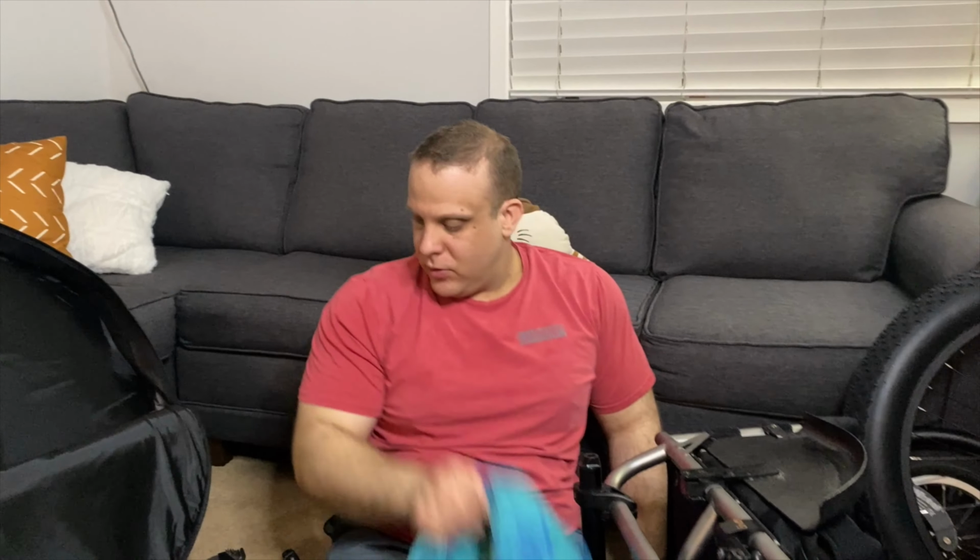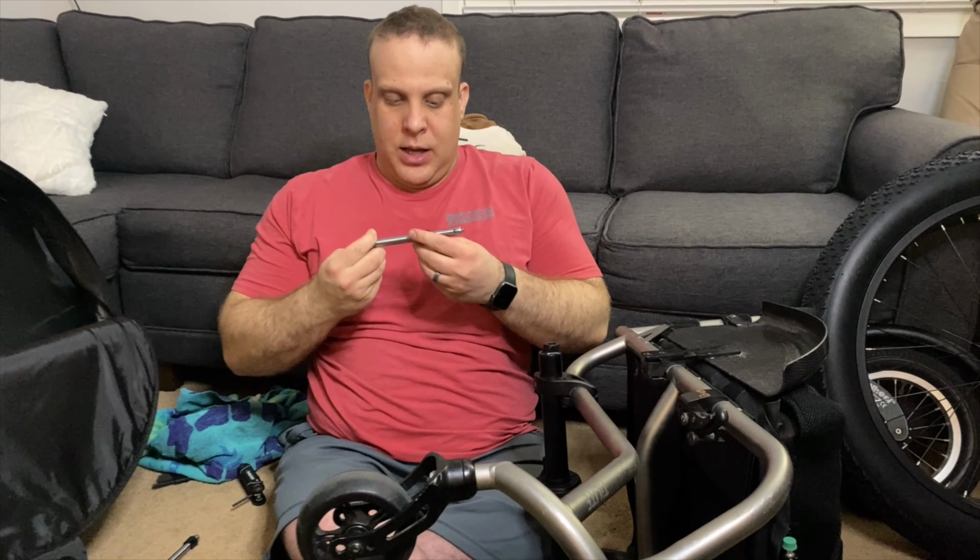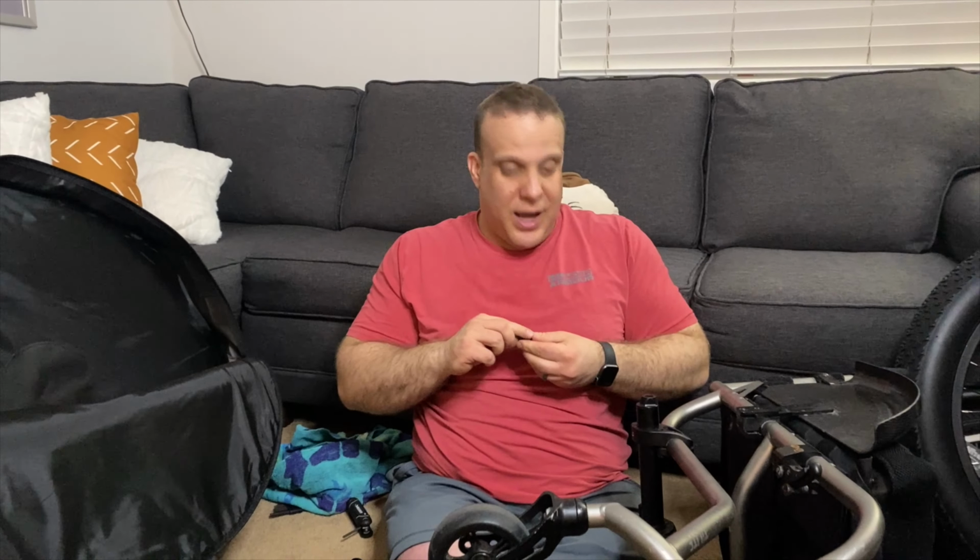We'll get some stuff out of the way here. Long axle. I'm using both spacers right now. So there's actually three of them that the wheels come with, a thick plastic one and two little ones like this. Depending on if you get these wheels and these axles, depending on your setup, you might have to use all of these. You might have to use only one of them. I need to use all of them.